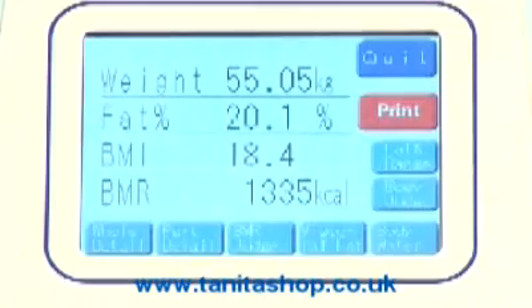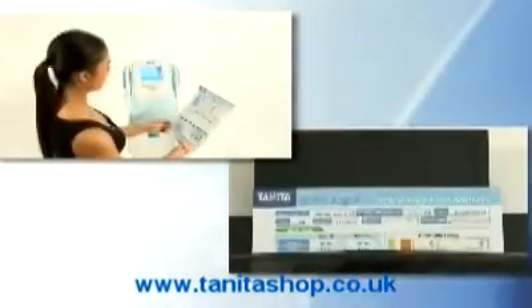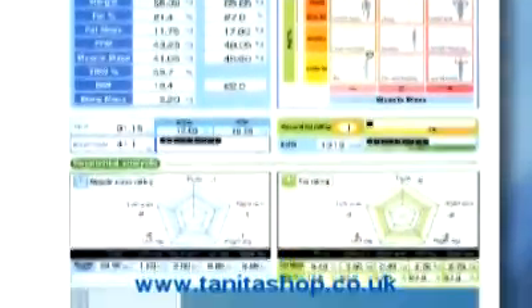A handy Tanita assessment sheet can also be printed with each measurement, showing an instant snapshot of the user's measurements in an easy-to-read format.